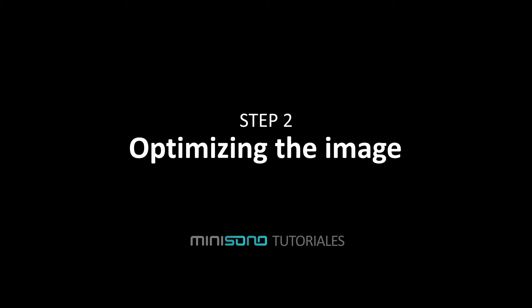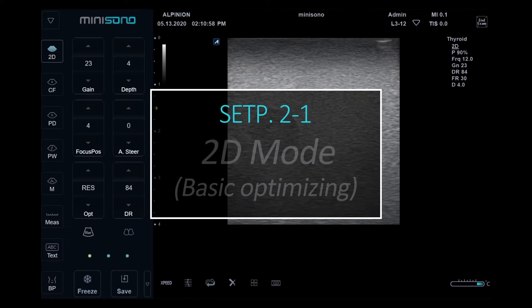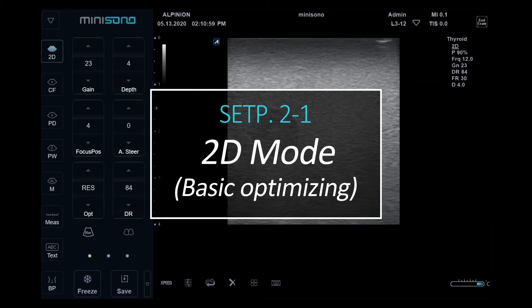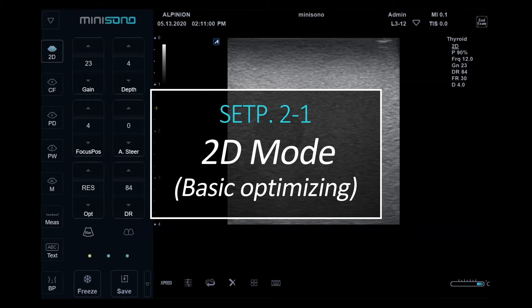Step 2: Optimizing the image. 2D mode. Basic optimizing.